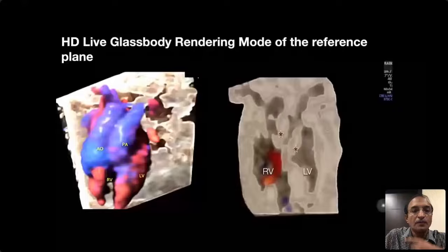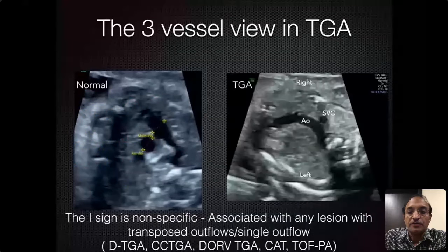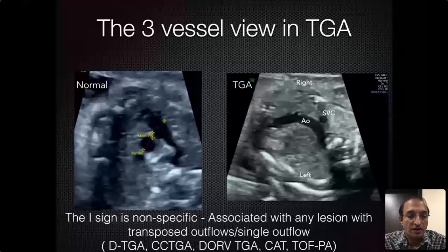The normal three vessel view is shown here. The three vessel view in TGA typically shows only two vessels. However, please note this is not pathognomonic or specific for TGA — it can also be found in corrected TGA, DORV TGA type, pulmonary atresia with VSD, and other conditions. So it is not a very specific sign.